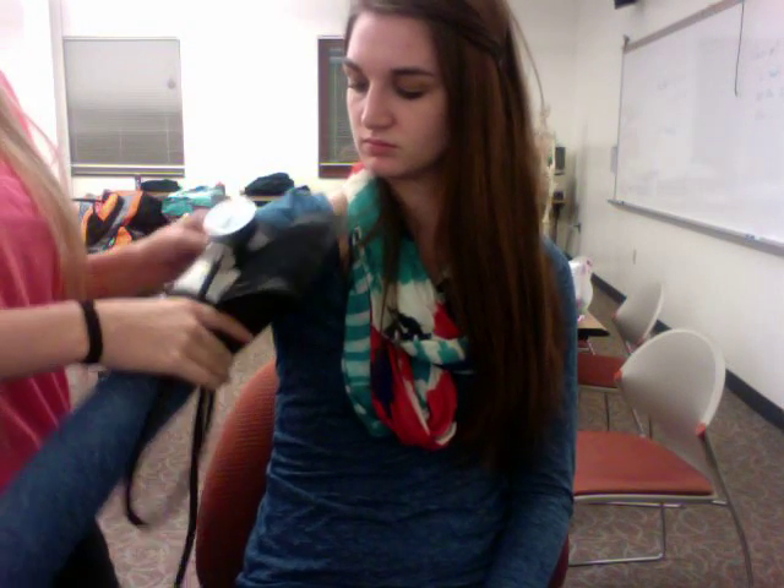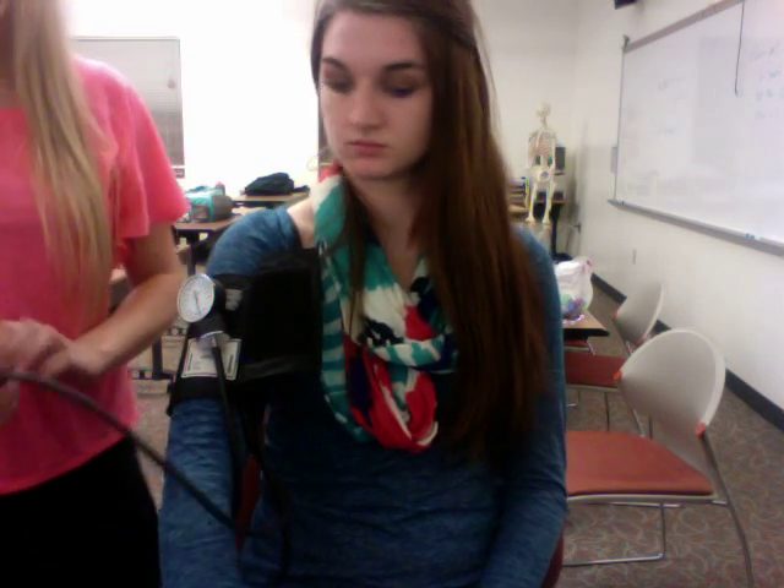Make sure with the patient with a long-sleeved shirt on that you do not push the shirt up to where it is bunched. If the shirt is thin enough, you can do it over the shirt. If they have a sweatshirt on, try to expose the arm the best you can.